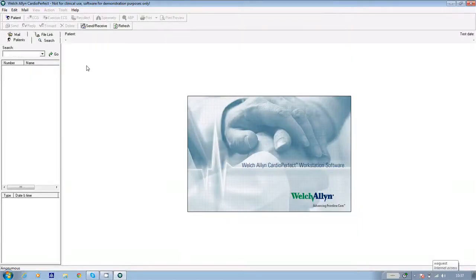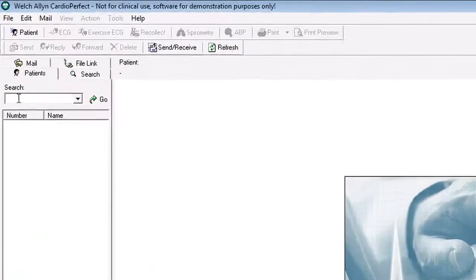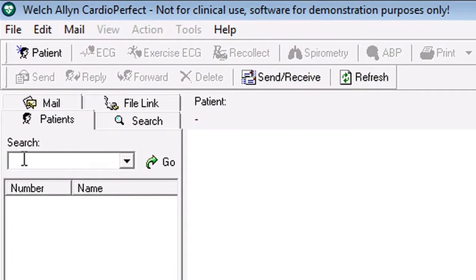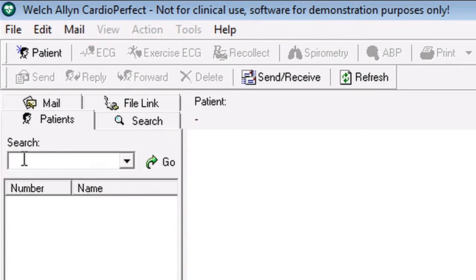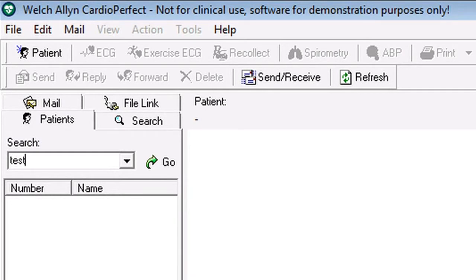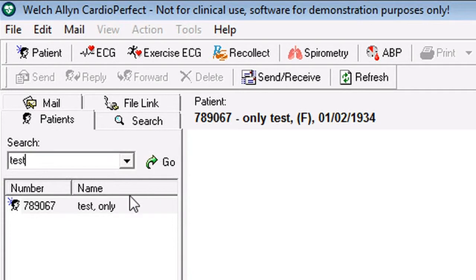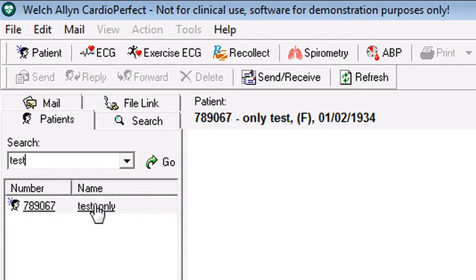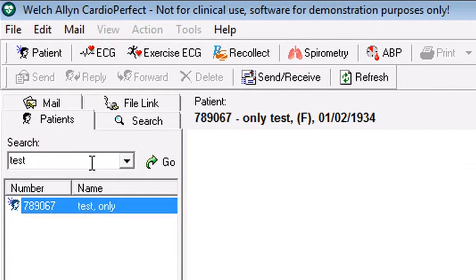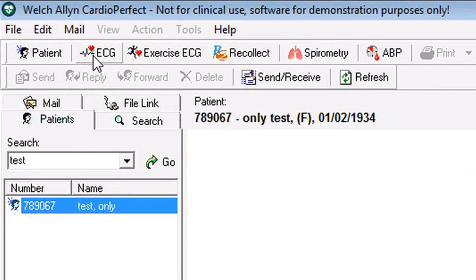If the patient has had an ECG before, you can find the patient's details in the database. To do this, use the search facility in the top left hand corner of the screen. If you click into search, you can search for the patient's name by surname and clicking on go and the details appear below. Highlight the patient's name and click on the ECG icon.